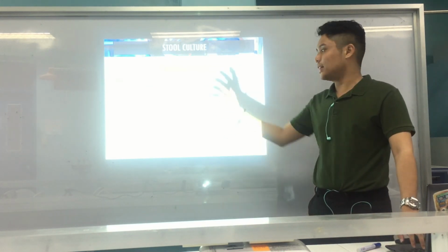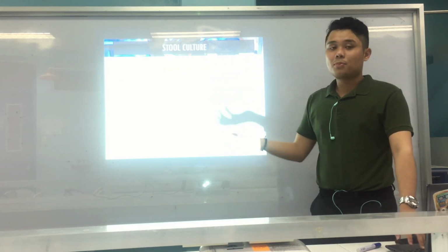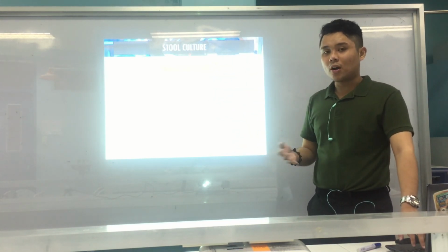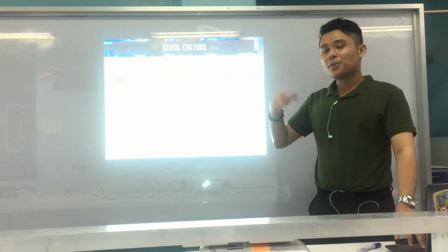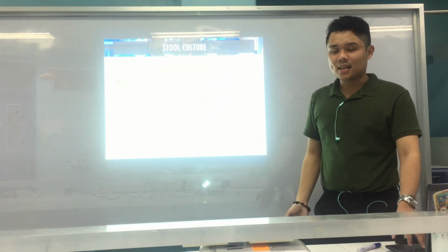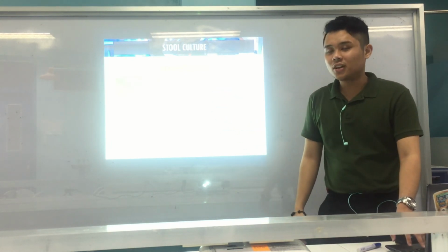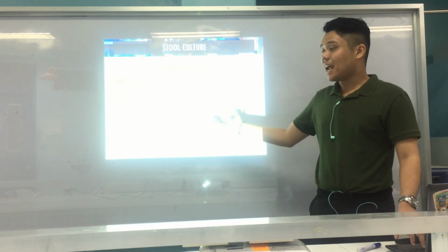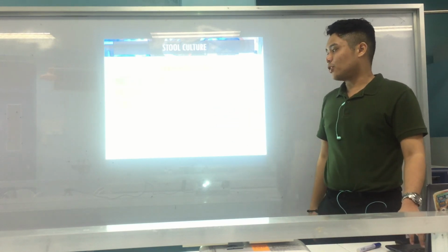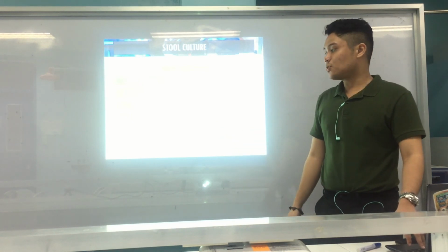Of course, enteric bacteria are bacteria that are recoverable from your intestinal tract, the normal flora of your GI system. Enteric pathogens are the pathogens that cause disease in the enteric or GI system. Coliforms are another term for lactose fermenters. And paracolon are your late lactose fermenters. Non-lactose fermenters, of course, as the name says, do not ferment lactose.